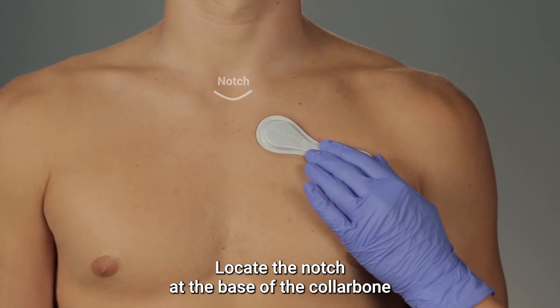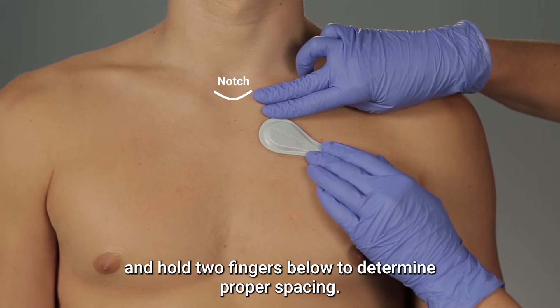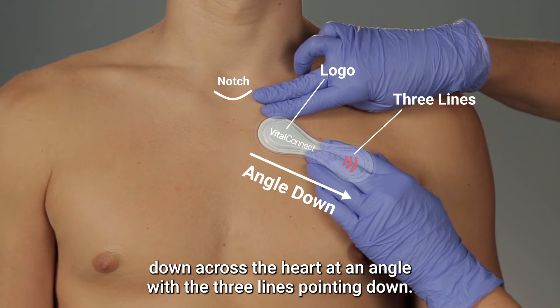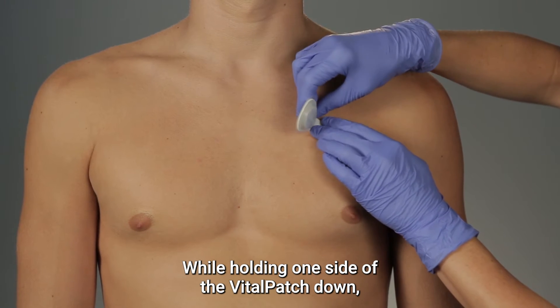Locate the notch at the base of the collarbone and hold two fingers below to determine proper spacing. Hold the Vitalpatch against the upper left chest with the logo side lined up with the center of the chest. Angle the Vitalpatch down across the heart at an angle with the three lines pointing down.